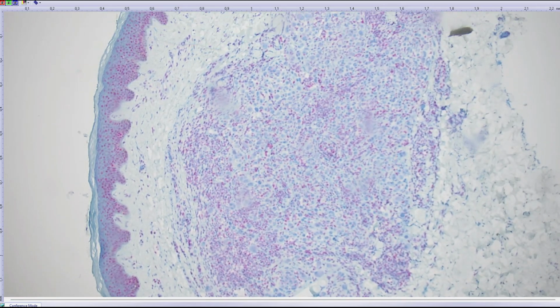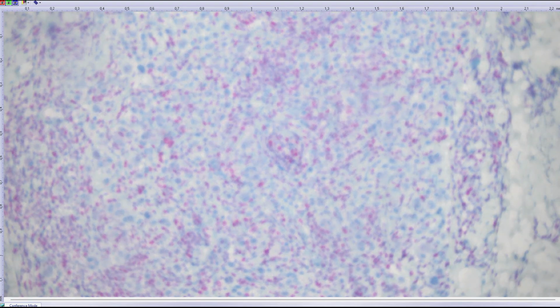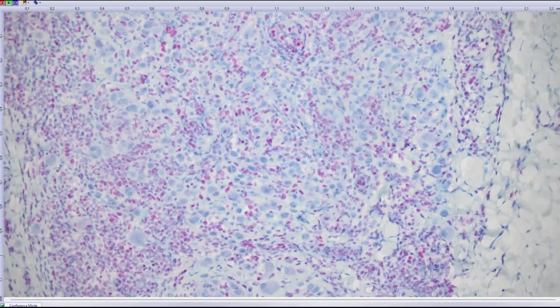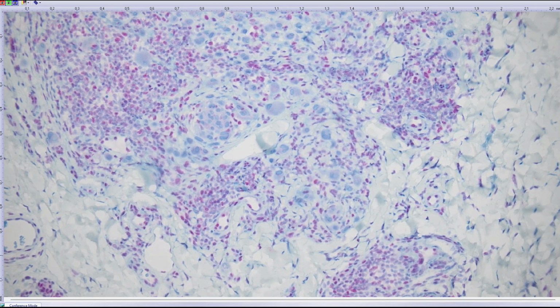I've had in between 2 more cases in the last 2 weeks. Look how nicely many of these large cells are BAP1 negative. The residual pigmented lesion is BAP1 positive. Even in this case it was mutated in genetics, so that we even found a BAP1 mutation. But in many cases you do not find BAP1 mutations. It is caused by some epigenetic changes, so the most decisive in these lesions is immunohistochemistry.